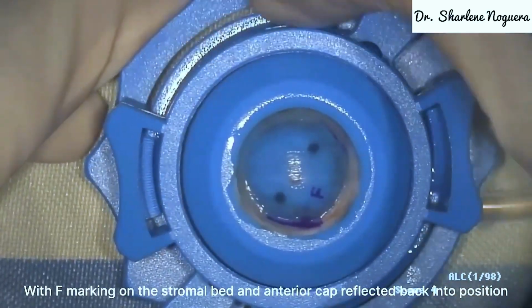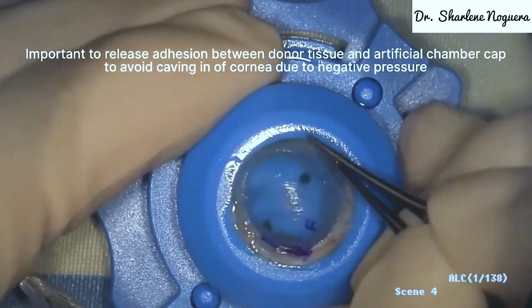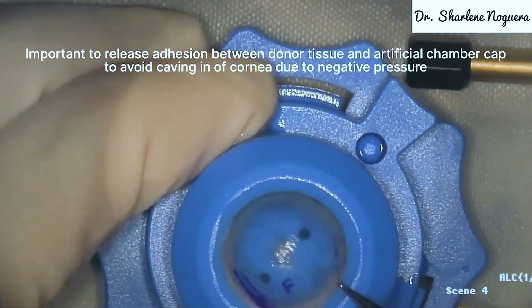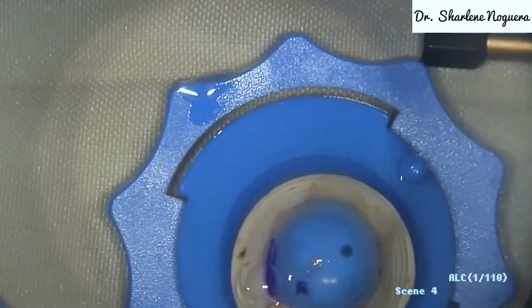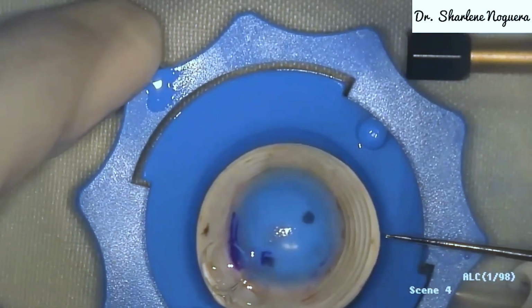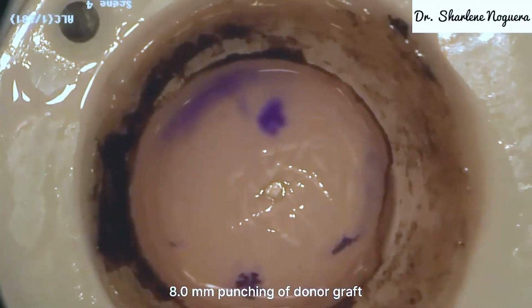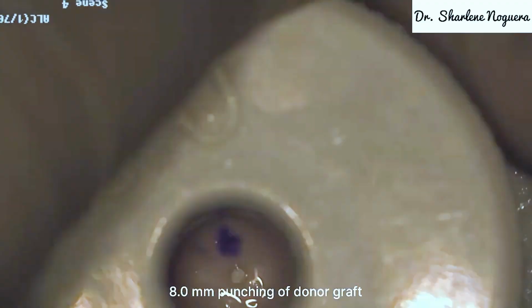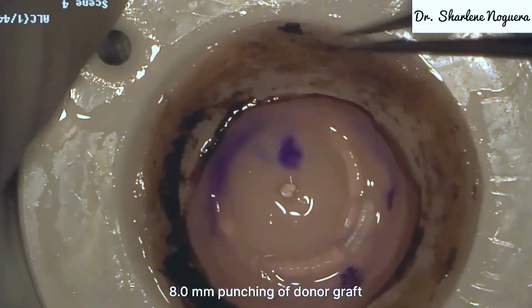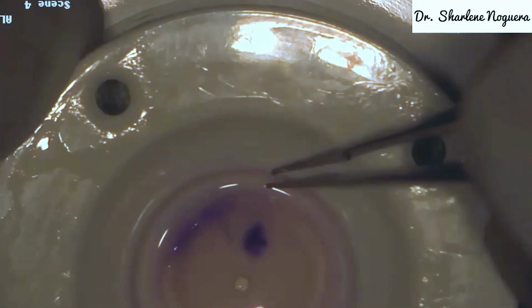It is important to release the adhesions between the donor tissue and the artificial chamber cap to avoid caving in of the cornea due to negative pressure. Then, the 8 mm punching of the donor graft was done. Use a cohesive viscoelastic to protect the donor endothelium.